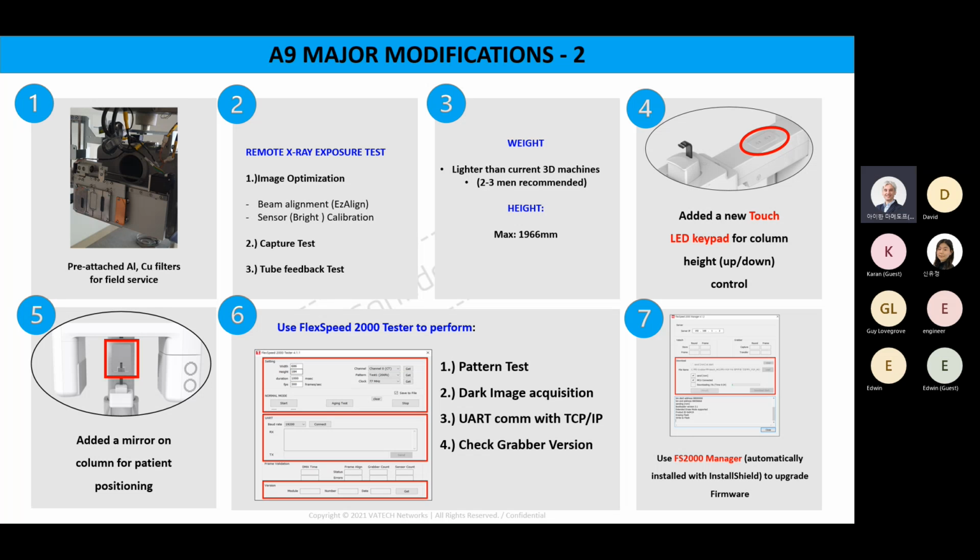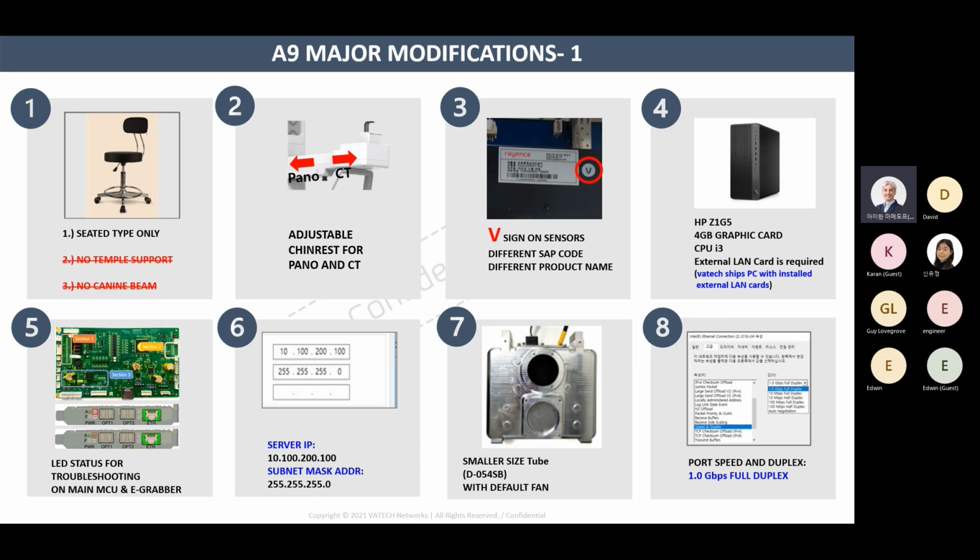So the FS2000 manager will be installed automatically along with the install shield, and you can use it to upgrade firmware. These new functions and modifications are the main thing that we are going to talk about today. This is just to give a general idea of what kind of changes we have on this new device and what kind of device you are going to get.